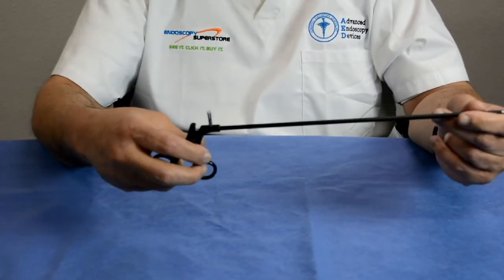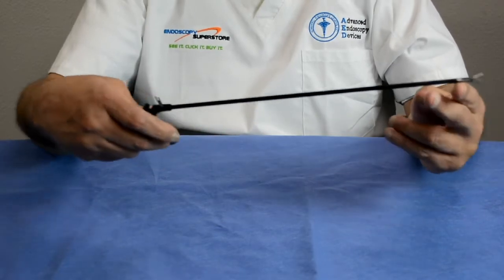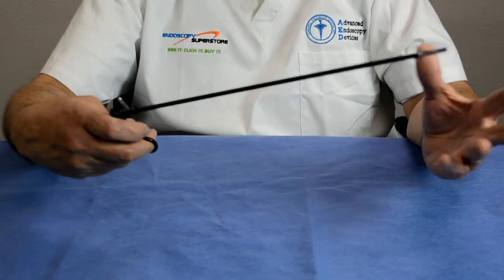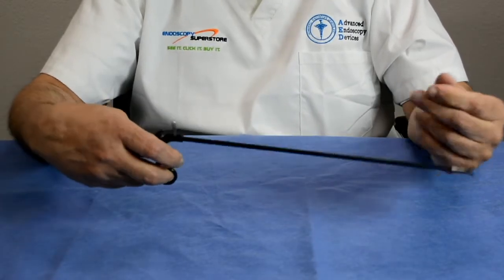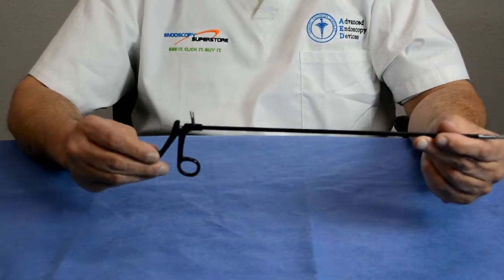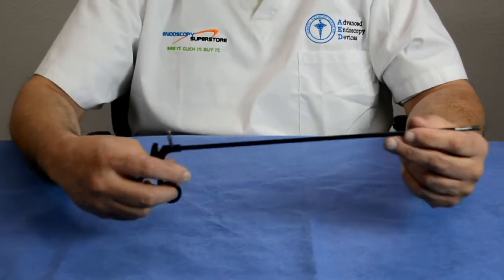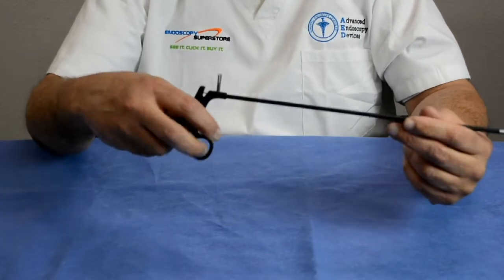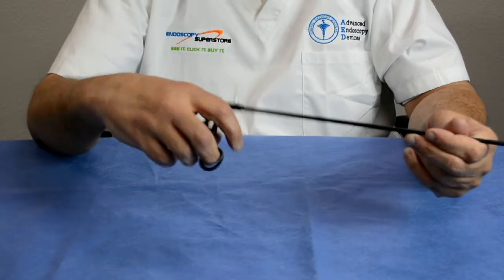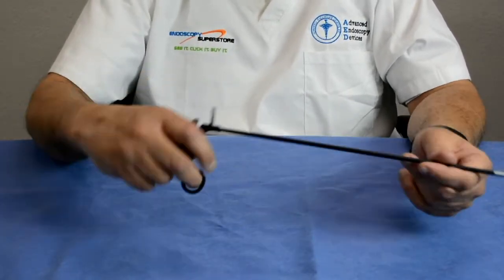This was the standard forcep used in the 80s when lapcoli started big. There was only a limited amount of jaw patterns — you had a grasper, a scissor, maybe a couple of dissectors, maybe a retraction forcep, and that was it. These were very easy to use and were what the first doctors used when they started doing laparoscopic cholecystectomy. They had really no choices, and it sometimes limited what they could do during the procedure.